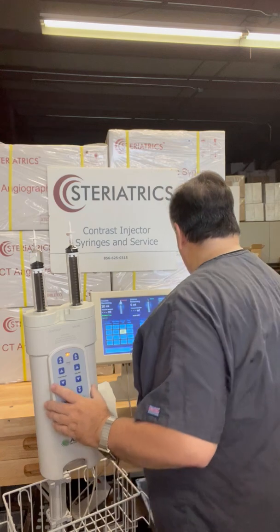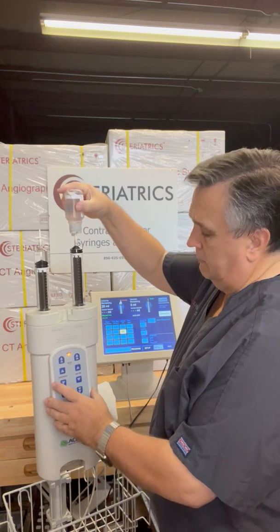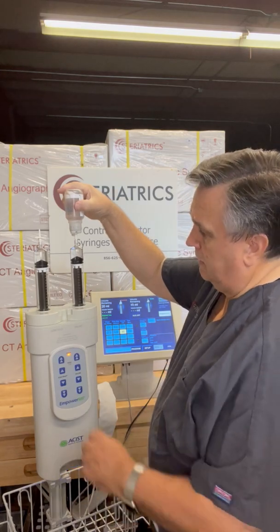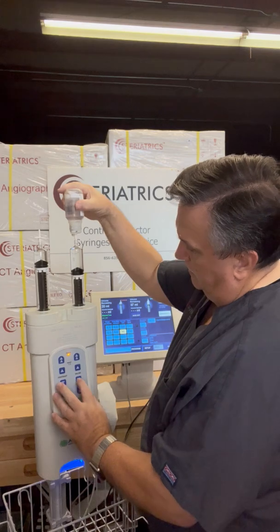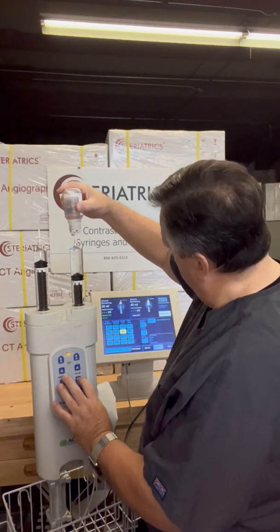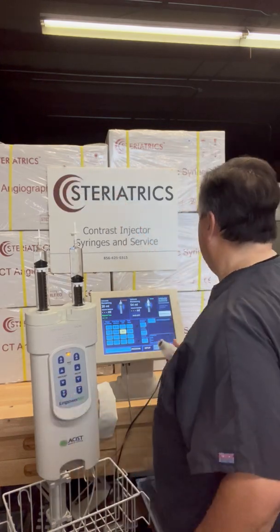Take that bottle off. Then the same thing with the saline side — since we're doing 50 cc's of saline, we're going to press and hold, then release, watch our level — there's 50 right there. We can press any button to stop it, so we overfill a little bit. Actually I'm only at 46, so we overfill a little bit, and then pop that off.